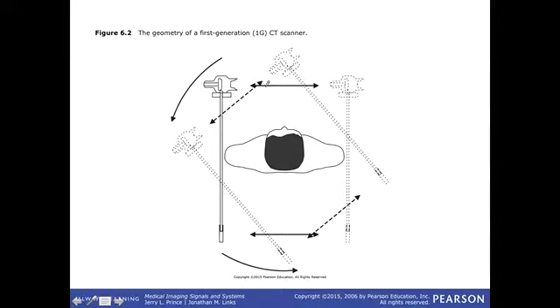What's another way of doing that? Do I have to rotate the gizmo? I can rotate the patient, right? So, you know, when Jerry Prince and I were having a burger at PJ's in Baltimore, I said, look, we should do 3D CT imaging just by putting a patient standing on a thing that rotates, stick them in front of a chest X-ray machine, and just spin them, right? So they just stand there like this, and you spin them.